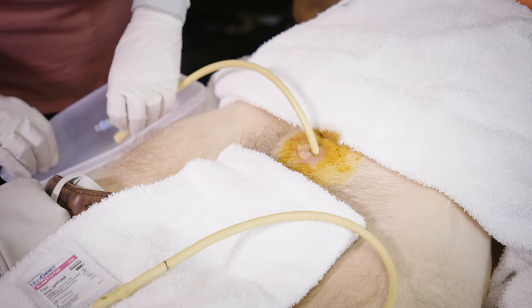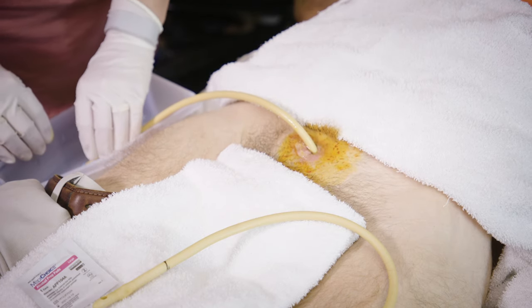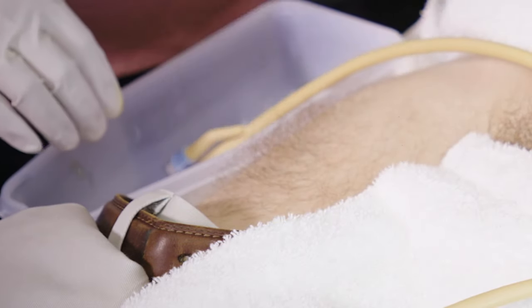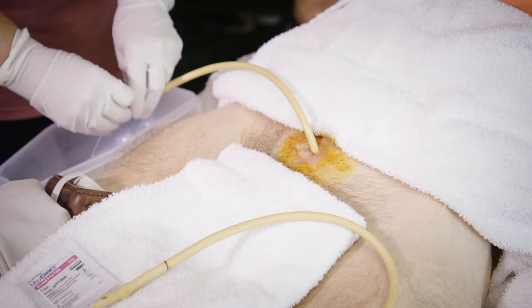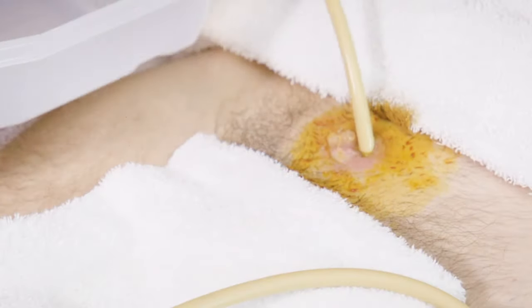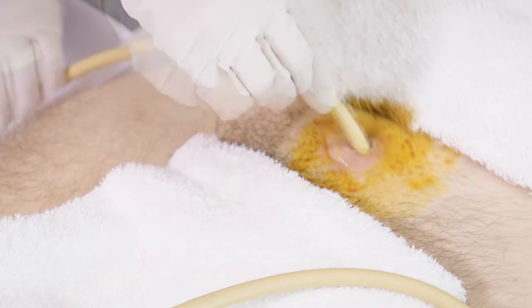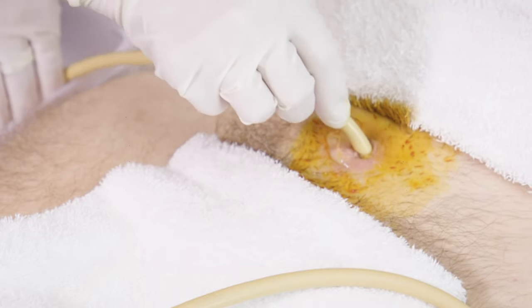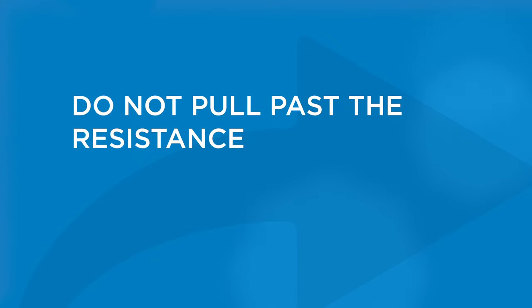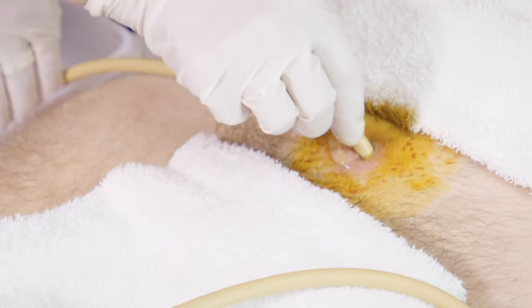If you haven't seen urine flow yet, move the tray down from the person's lap with the end of the catheter inside the tray next to the patient. This allows for gravity to work in your favor. You should start to see the flow of urine within a few seconds. If you don't see urine right away, don't panic — sometimes it can take up to two minutes for urine to flow. Check the position of the catheter. Grab the catheter and push it in about a half an inch to an inch, then gently pull it back the same distance. As you pull back, you should feel resistance; this is the balloon catching against the edge of the bladder. Do not pull past the resistance. This in and out motion should be an easy glide.